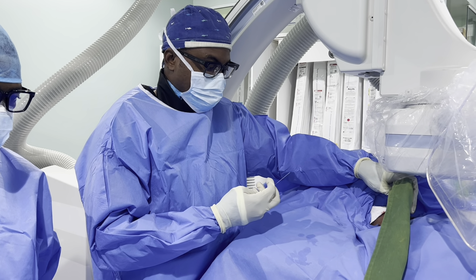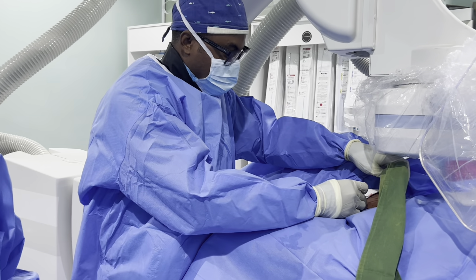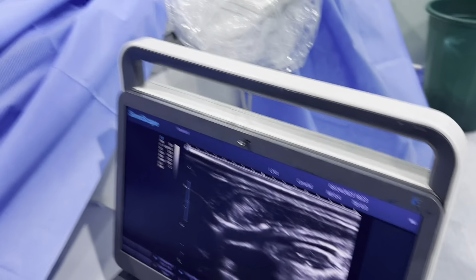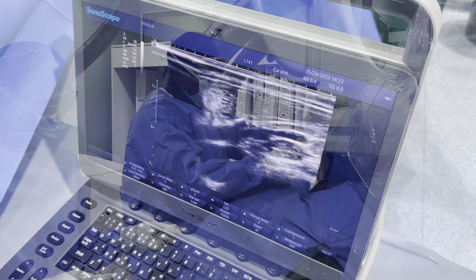We started a varicocele embolization, so we're currently getting access into the internal jugular vein. This is going to be our access for the entire procedure. You can see the needle going into the internal jugular vein there.